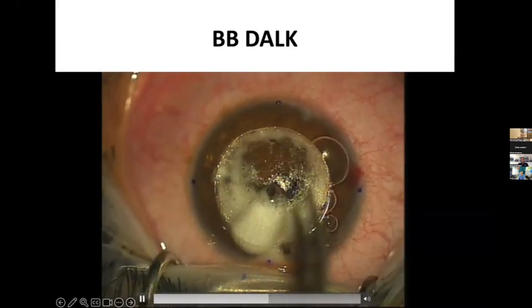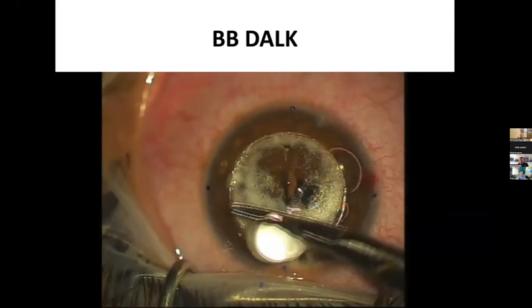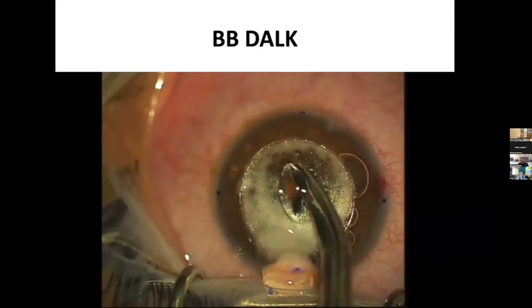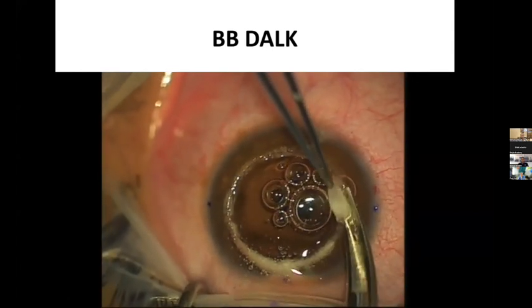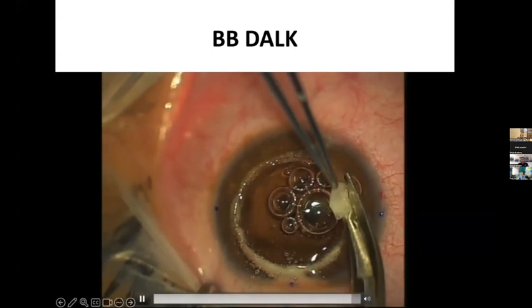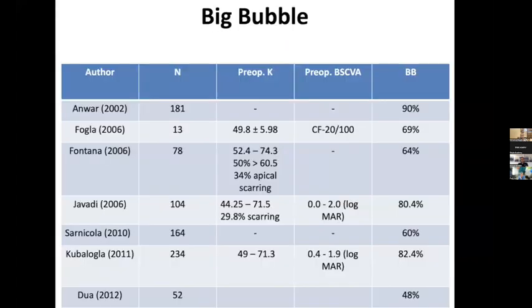Doing a Brave slash, evacuating the air and replacing it with viscoelastic, then removing the stroma, dividing it into quadrants and removing the whole stroma, leaving Descemet membrane covered with a thin layer of the stroma, which we call the pre-Descemetic layer or Dua's layer. So this is the classic big bubble technique, which makes our lives easy and makes surgery fast with a perfect interface. But usually this doesn't happen in most cases.